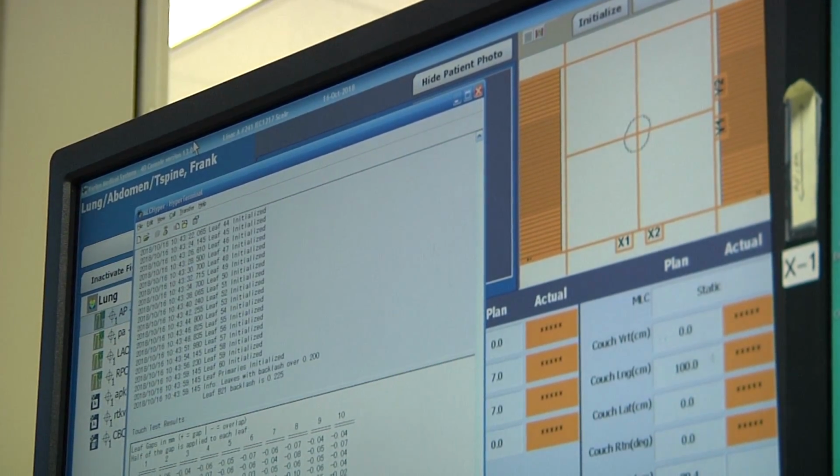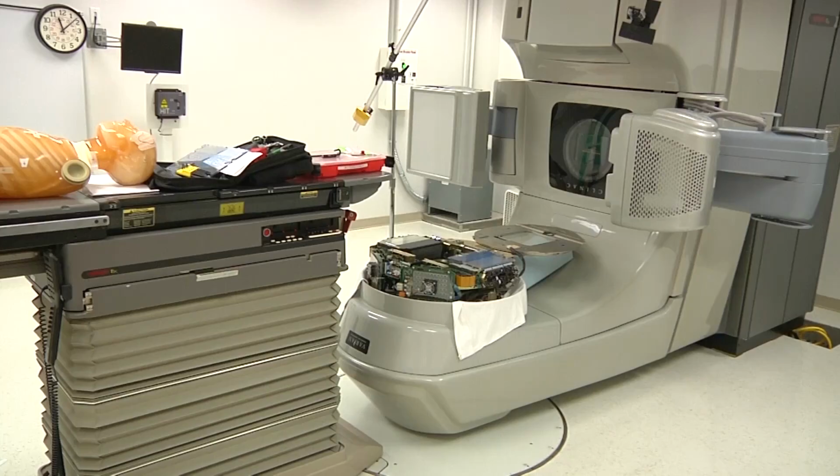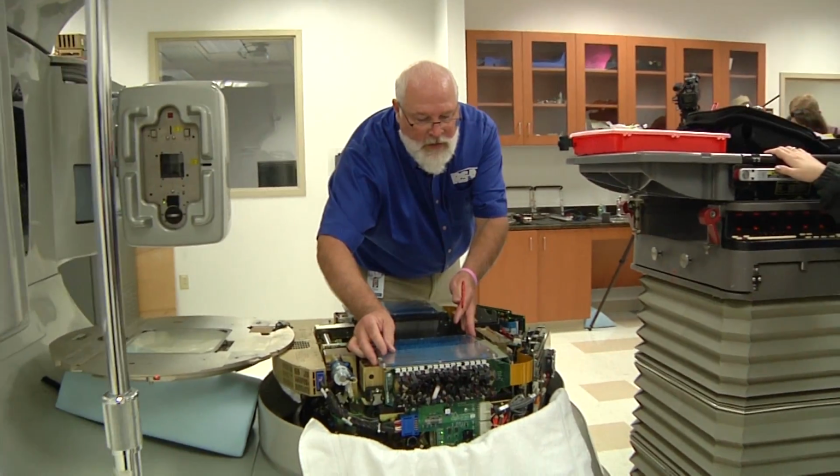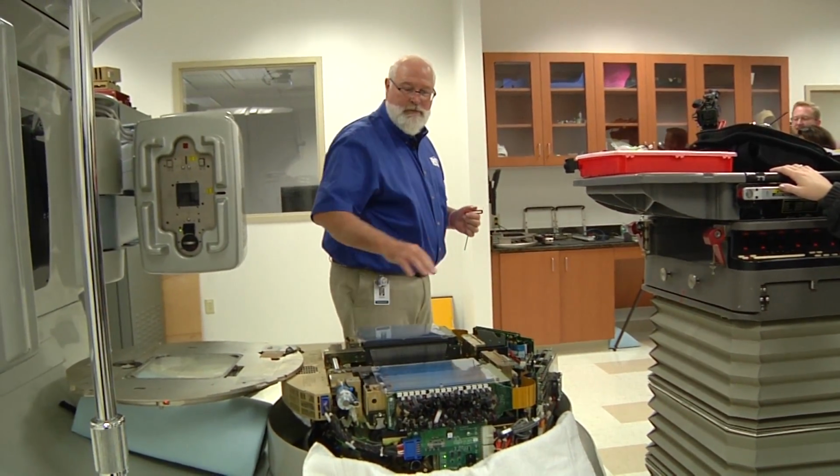So now we'll go back in the room and have each one of you pull a motor out and put it back in. We could have 2 people at a time do the A side and the B side. Okay? We're just going to use the easy motors. We're just going to grab ones on the ends.